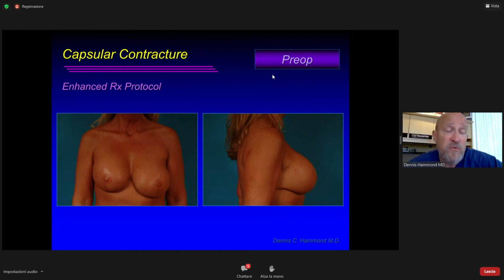And actually, if we have what we suspect to be an infection, we've used the hypochlorous acid. The trade name for it is Phase 1. I have no conflict of interest with it. We've actually been able to salvage every infected implant that we've seen with it. These patients have drains in. What we do is we irrigate the pocket with the Phase 1 after first irrigating with saline, and we've been able to completely clear the infection.